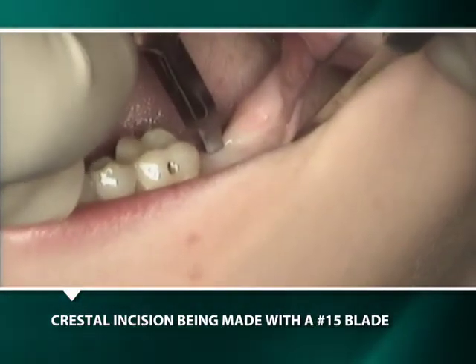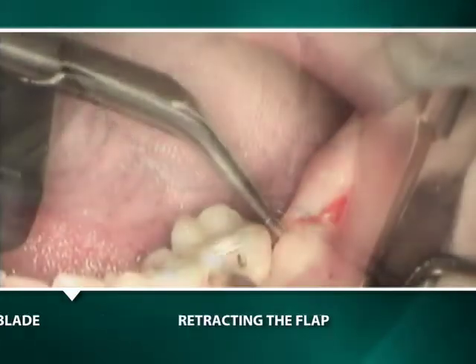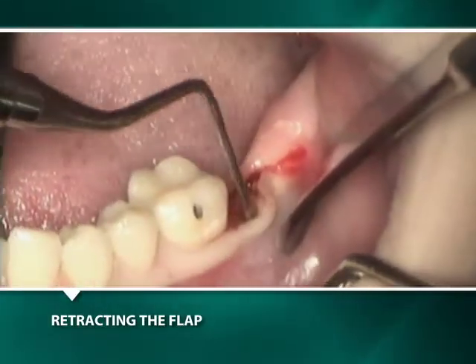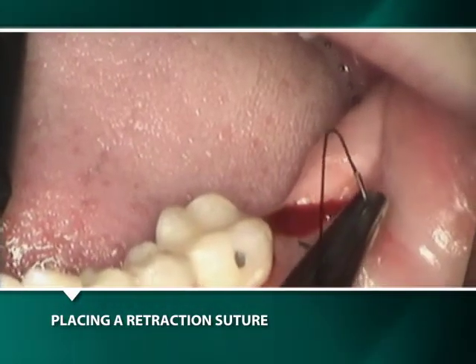Due to the difficult access, a non-papilla-bearing crestal incision is made. In order to allow for full visibility of the crestal bone from the buccal flap, a silk retraction suture is used to hold the flap open.